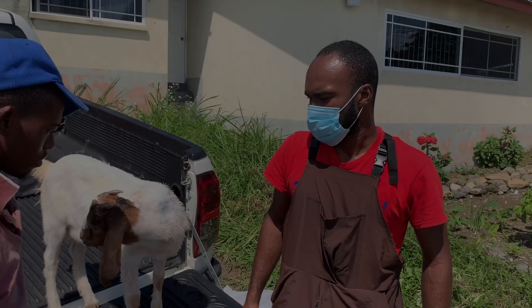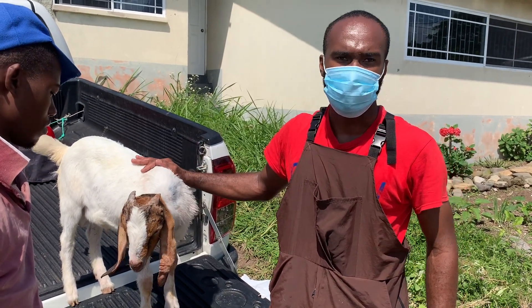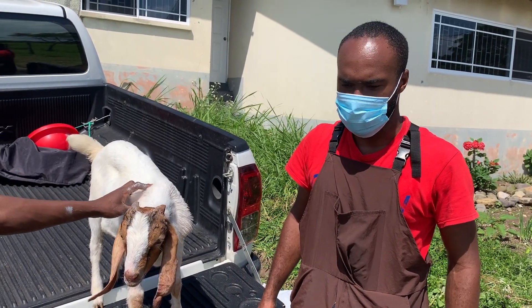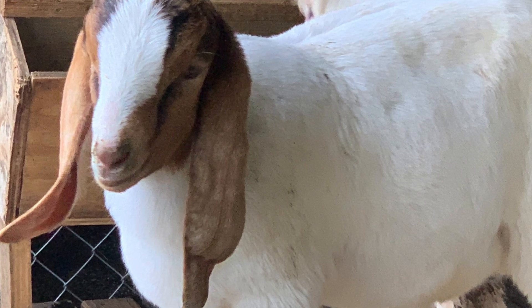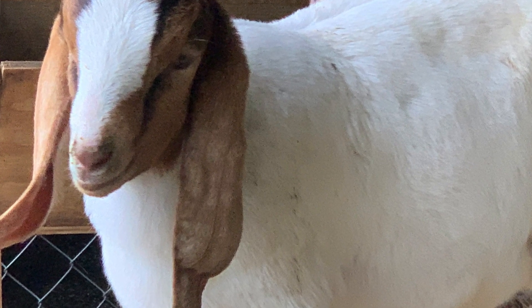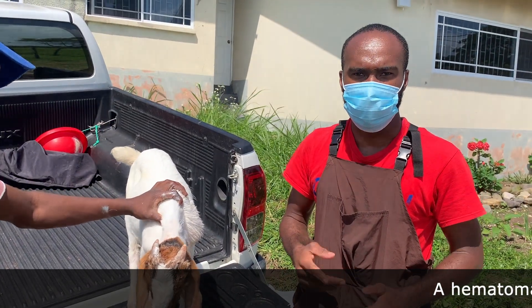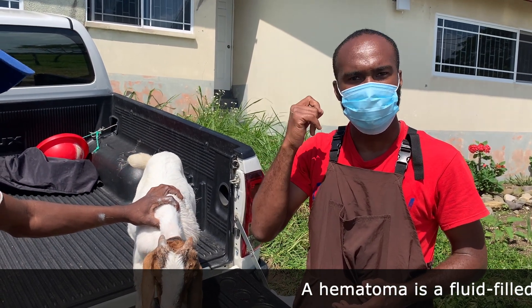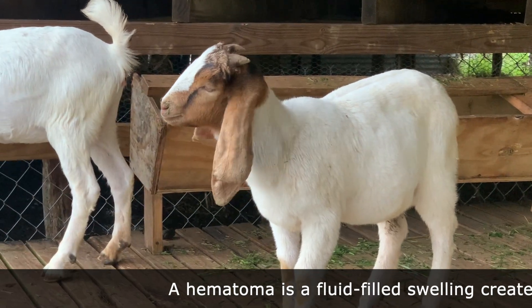So we just completed our aural hematoma repair. In scientific terminology, we pretty much tried to correct the accumulation of blood and fluid in the ear. An aural hematoma, in simple layman's explanation, involves the capillaries — the small blood vessels in the ears — rupturing.